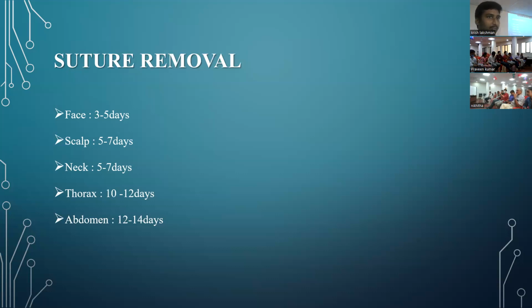Yeah, there is no strain. That is the role of the suture. Beyond that, like I said, when the collagen laying happens, that is when actual healing takes place. After that, the suture has no role. After that, the suture will only give you more scarring. So you have to take a decision as to when you want to take your suture out.